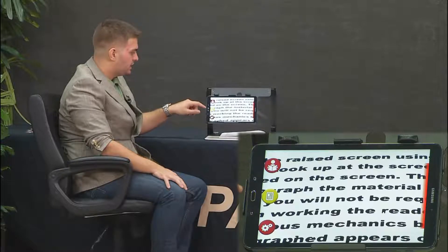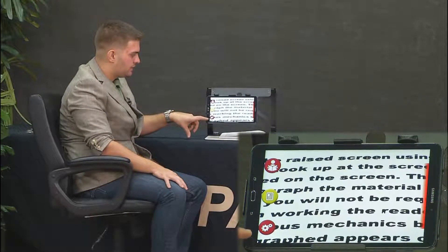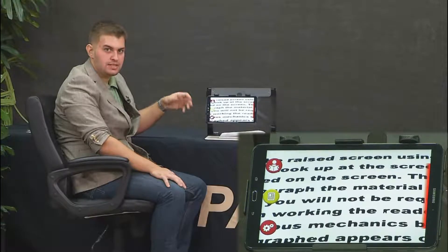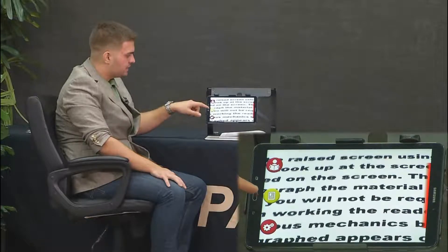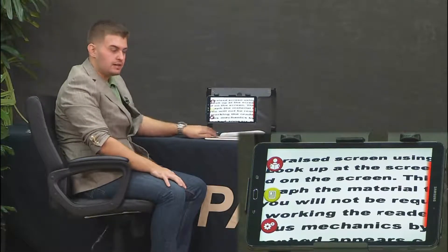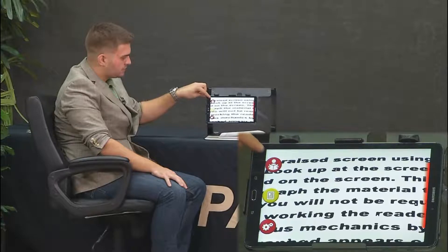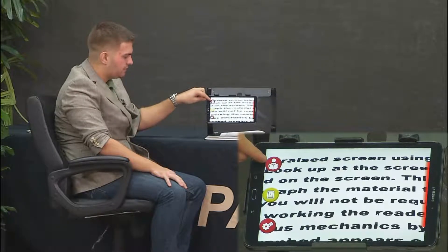I'm going to walk over some of these buttons. The first one on the bottom left gets you inside the settings to change the volume, rate, language, and the voice it speaks in — either female or male. The second icon is to freeze the image you're looking at, so you can navigate around with one finger on that frozen still image. The last icon is the reader icon, which switches between the reader and the magnifier.